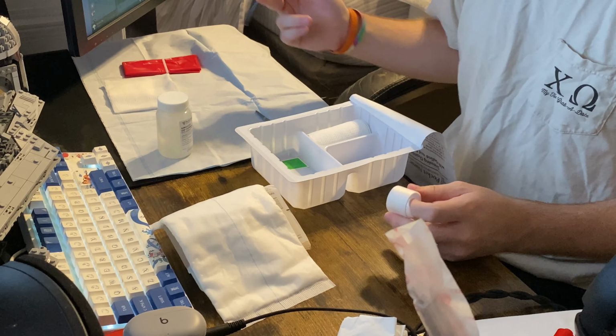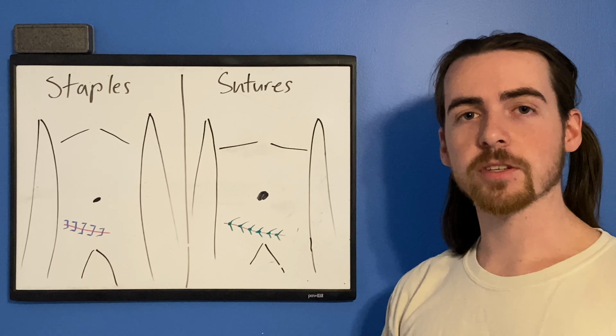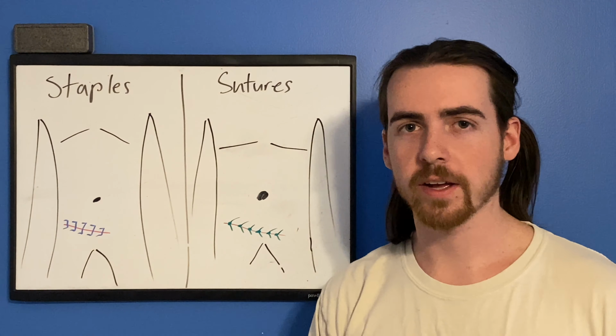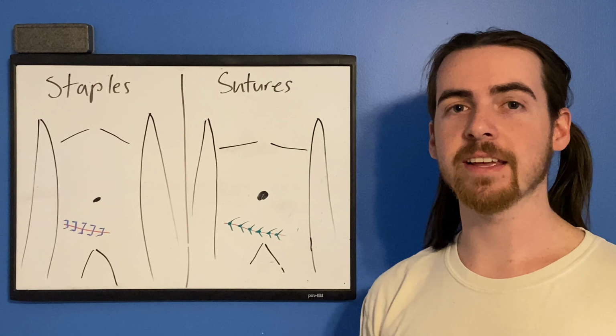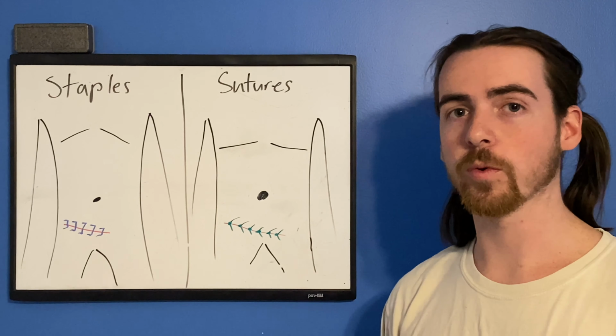For the final part of this video, we're going to be discussing how to safely remove sutures and staples. I don't know the rationale for why a surgeon would choose to use one or another to close an incision, but it is important to understand how to safely remove either when preparing further wound care.